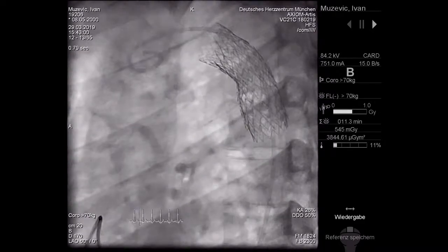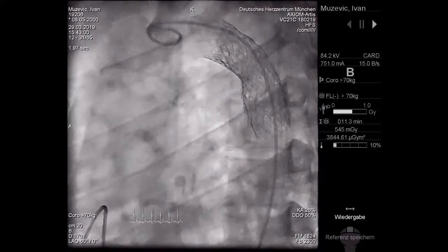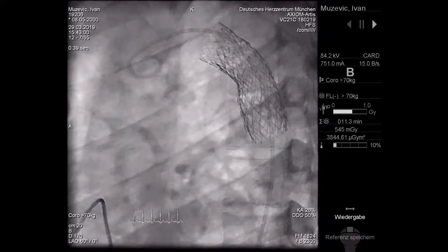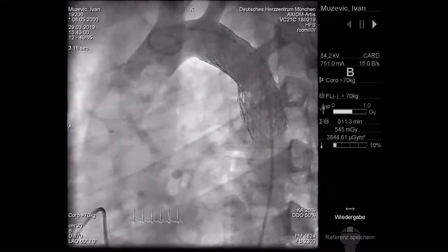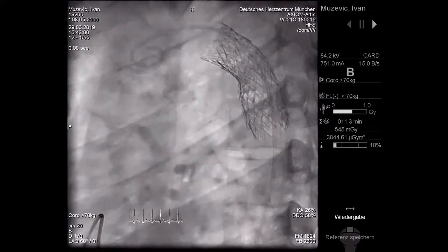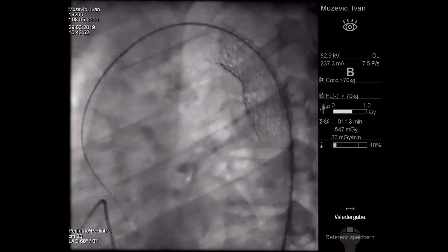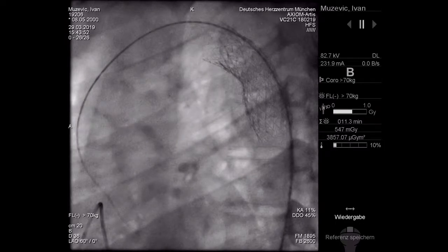The third stent was a covered stent? No, nothing is covered. They're all bare metal. So the distal part of that. I was so happy with the curve of the stent, and when I now dilate it, the curve will go out probably, but we will see. So you're going to redilate with the 18, that distal part of the transverse arch, to try to get that a couple millimeters bigger? Yeah, well, we try to shape the stent in an ideal fashion.